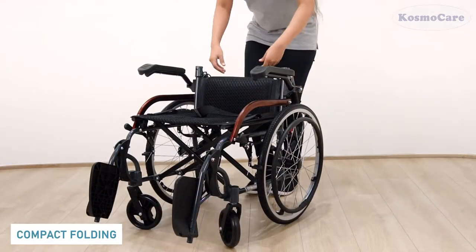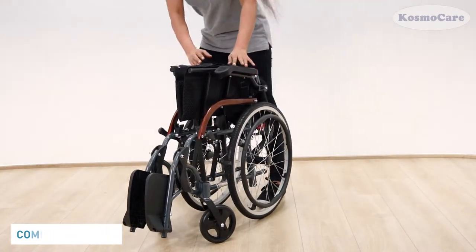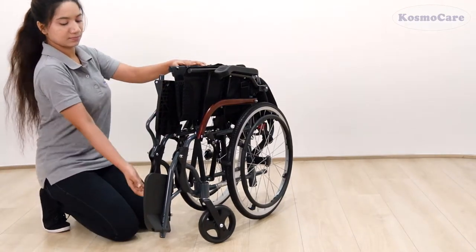Simply pull both the drop back levers simultaneously to fold down the back support, then pull the side seat straps up to collapse the frame. Then flip up the footrest to fold the wheelchair.